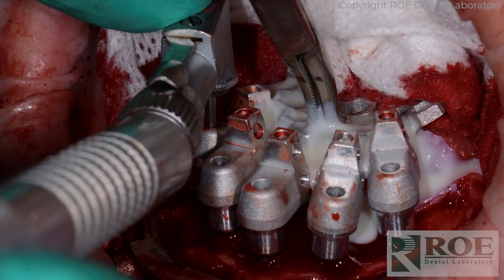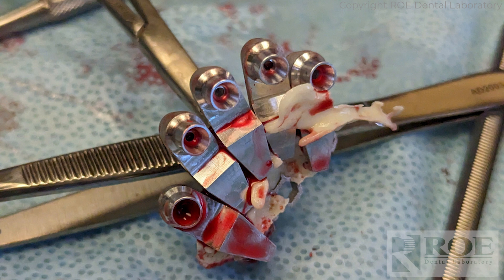The frame is placed upside down — it seemed to fit better that way — and luted with Stellar Acrylic, then light-cured. That's all you do with the OptiSplint. Quickly remove it. We don't scan the OptiSplint in the mouth; it's optional if the doctor prefers it, but these are very bloody surgeries and it's much nicer to scan it outside the mouth in a more controlled environment.